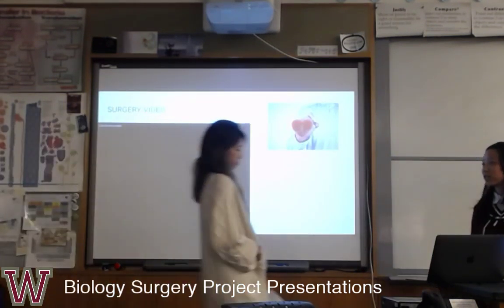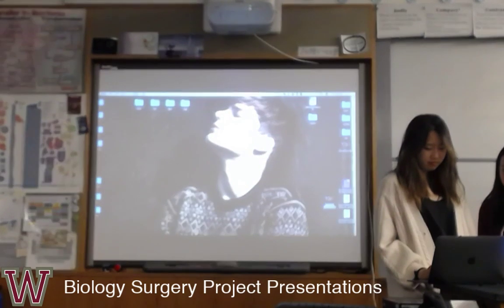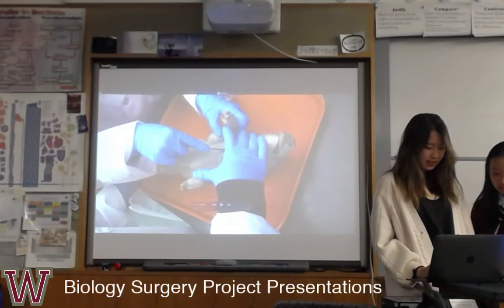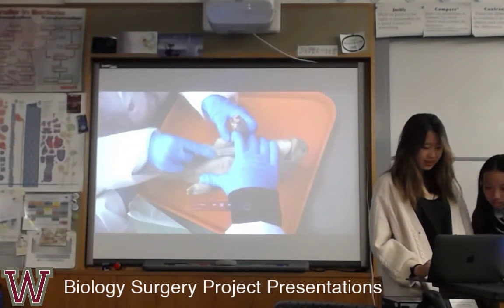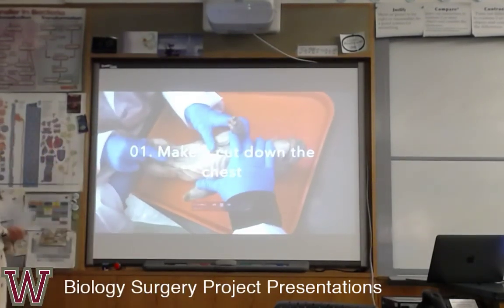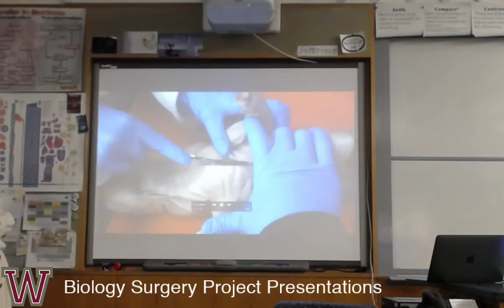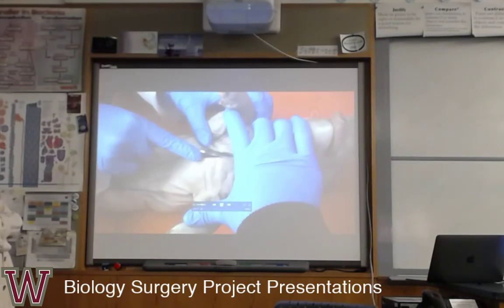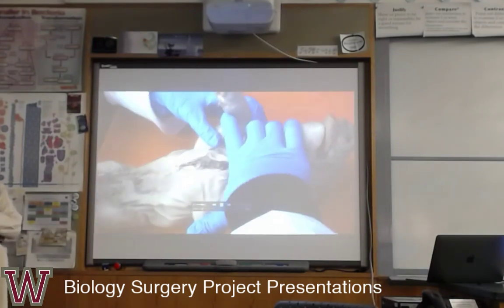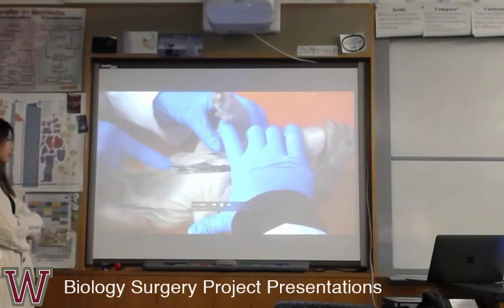So we are going to show our video. This is the first step, in which we tried to cut the skin and separate the breastbone in order to find the location of the heart.